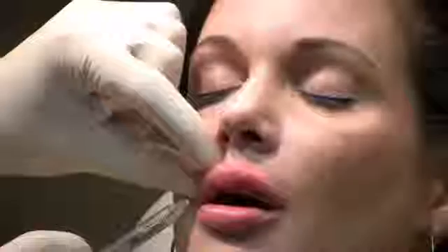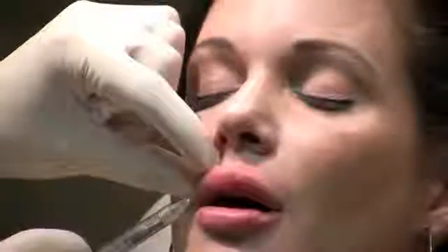Put the lips together again. Her right side is naturally a little bit less full than the left side. A little more on this side. And we're done with the lips. That took about three-quarters of a syringe of Juvéderm, and we had done about a cc just a few months ago, so this is just adding on top of that.